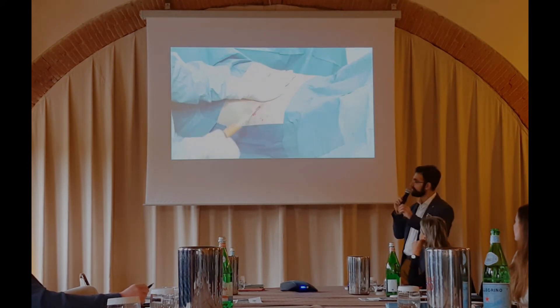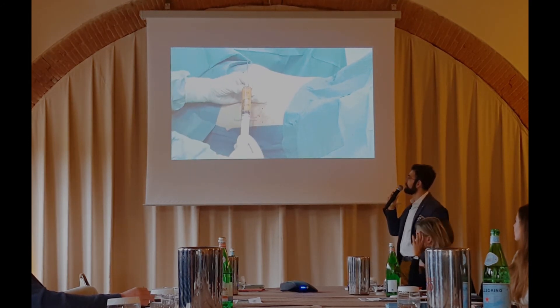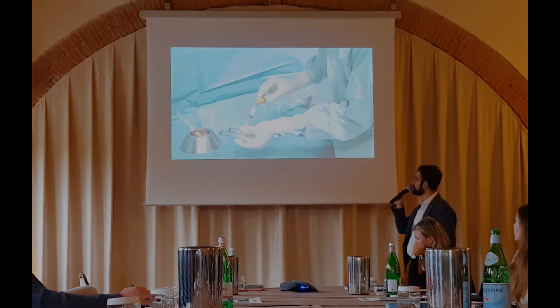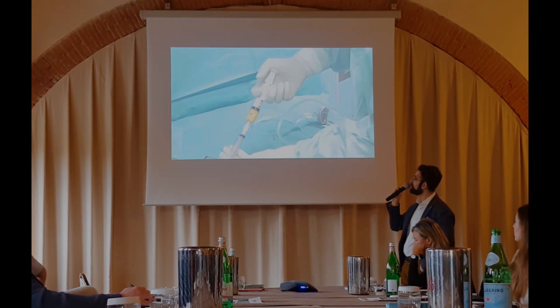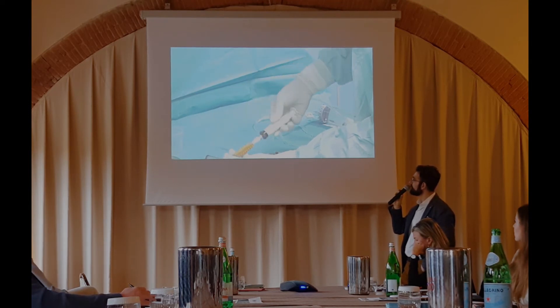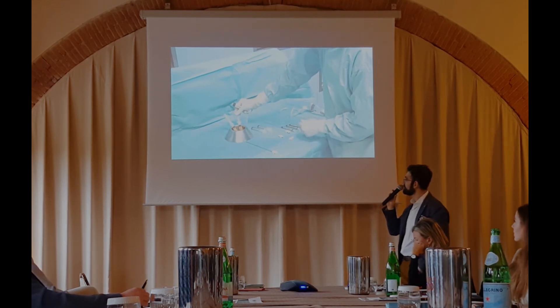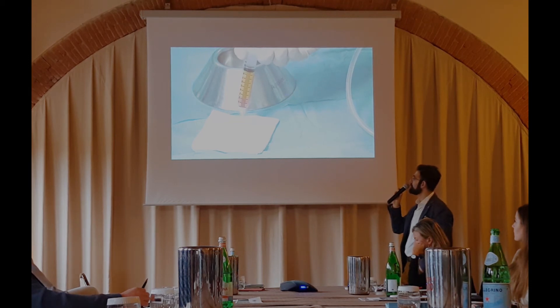It's good if it's yellow — sometimes it's orange, sometimes it's red because there is a little blood, but it will be cleaned during the process. Then we transfer the adipose tissue from the luer-lock syringe into 10cc syringes, as shown, and leave them to decant. At the end, we remove the solution that has stratified.